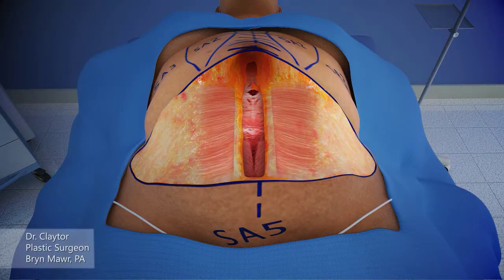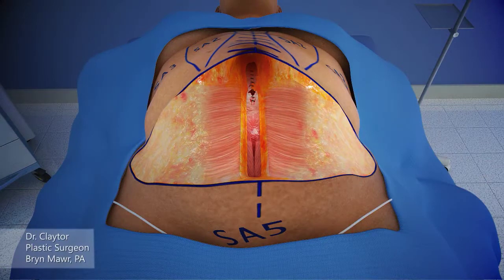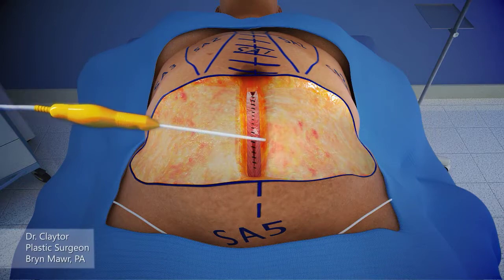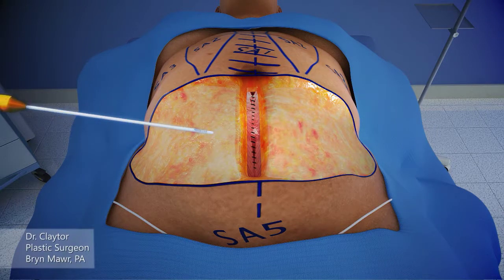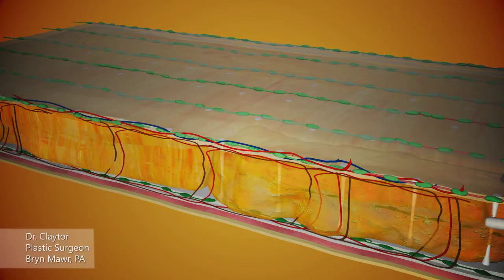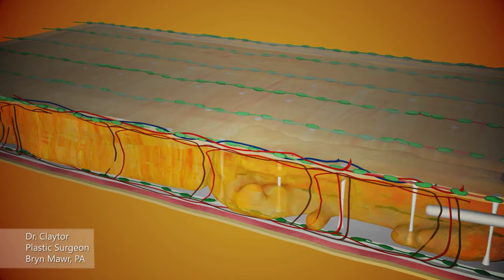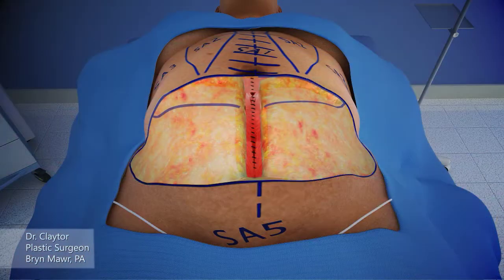Following this, the rectus diastasis is repaired from the xiphoid down to the pubis. If the Scarpa's fascia still has any thickness, it is liposuctioned at this level. The green dots indicate the lymphatic drainage and the layer of Scarpa's fascia. The liposuction is being done superficial and deep to Scarpa's fascia.